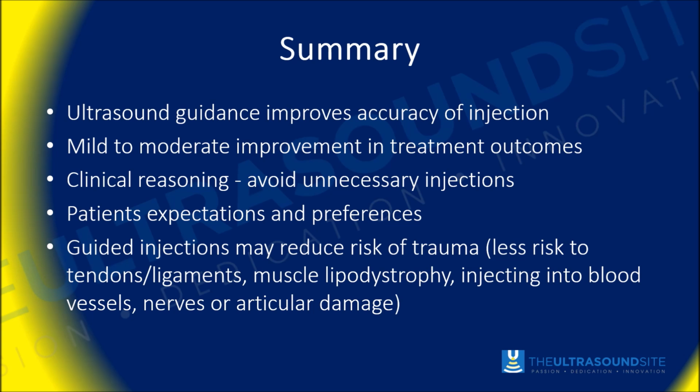So, in summary, ultrasound guidance improves the accuracy of the injection, and that's been pretty much now beyond reasonable doubt, if you like. There are oftentimes recorded mild to moderate improvements in the treatment outcome. Clinical reasoning allows us to avoid unnecessary injections, so that's another potential advantage.